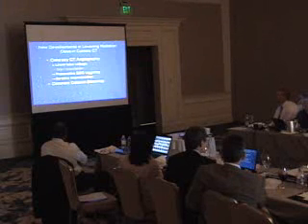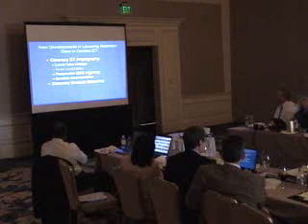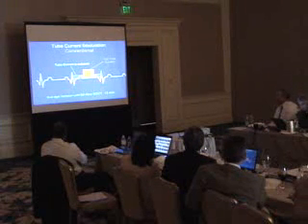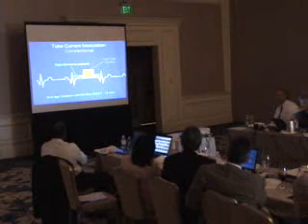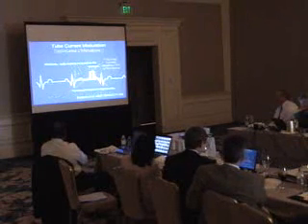The second approach that's employed, with the standard technique we call retrospective gating for CT, is to use dose modulation. Instead of having the tube current turned on throughout the cardiac cycle, which is the way CT started, you have full tube current only for a portion of the cardiac cycle.